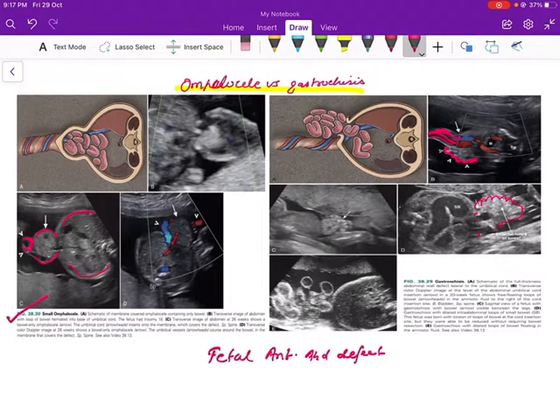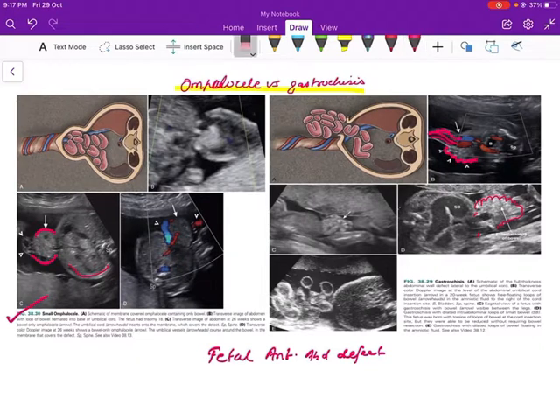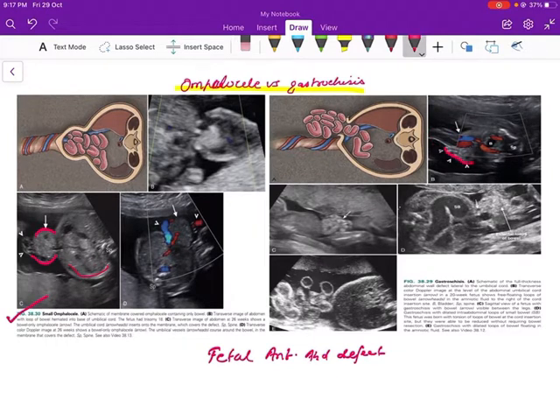Also observe that the herniated mass has a very regular shape in cases of omphalocele — the outline of the herniated contents is very well defined because they are covered by a membrane. While in the case of gastroschisis, the outline is not very well defined because there is no membrane covering the herniated mass.